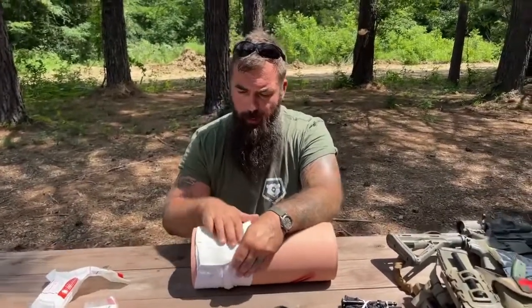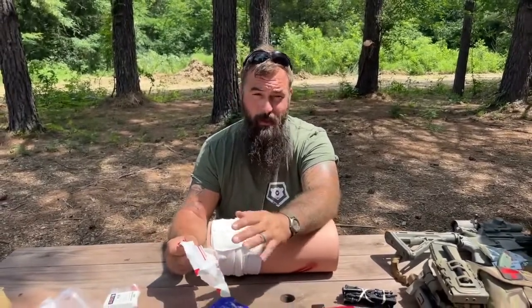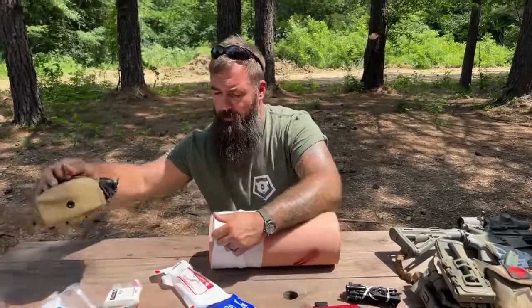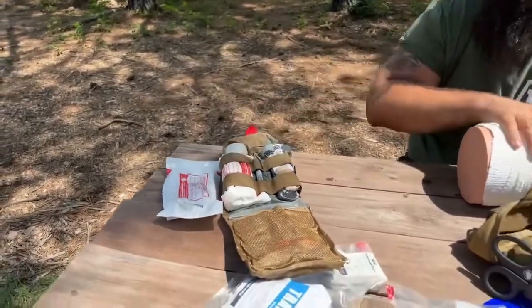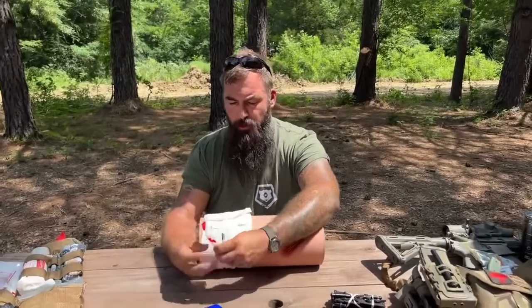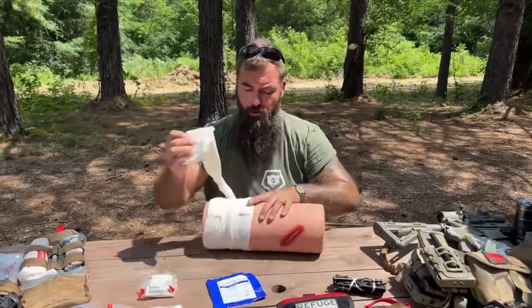That's wound packing and pressure bandages in a nutshell. Pressure bandages are also known as Israeli dressings — same concept. I really like these ETDs, emergency trauma dressings from North American Rescue. Olaes makes a phenomenal pressure bandage too; we use those in some of our kits. Whether it's compressed gauze or a hemostatic agent, we're going to back it with a pressure bandage to hold that in and apply pressure to collapse the bleeding vessel and stem the flow of blood.